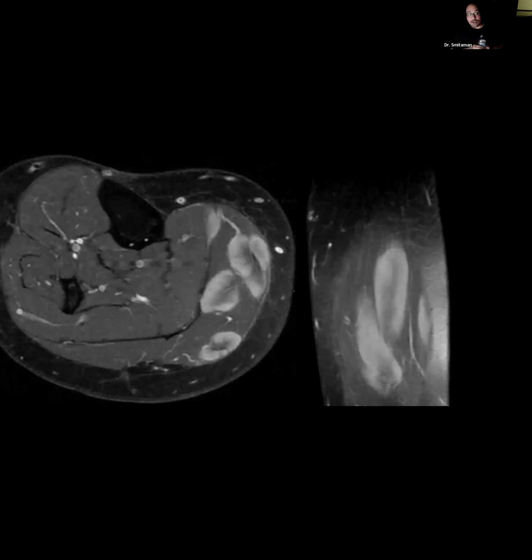This was a case of sarcoid, a disease, as we know, non-caseating granulomatous process in muscle that can present as two types, diffuse or nodular, nodular as in this case. When you're dealing with the diffuse type, it'll just look diffuse, and a gallium-67 study may help you to diagnose it in that case. But in the nodular type, it's typically more obviously nodular, distinct, and can be seen in about 1 to 5% at most of patients with sarcoid.